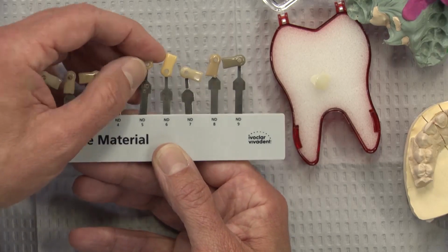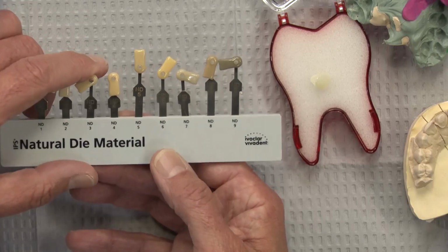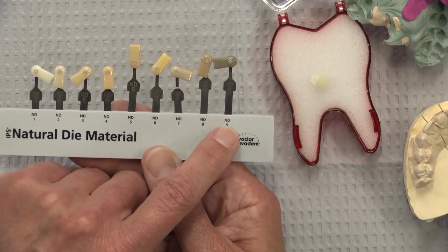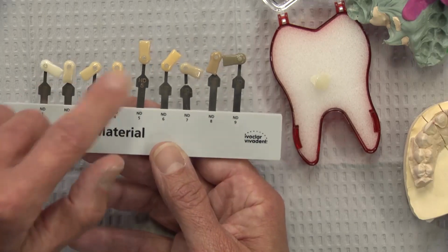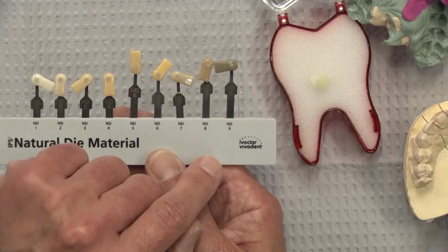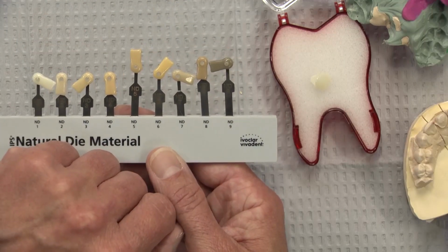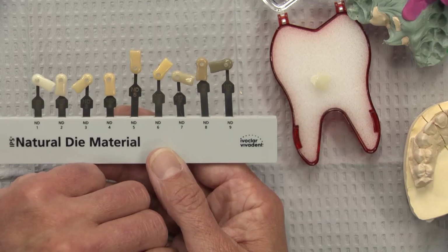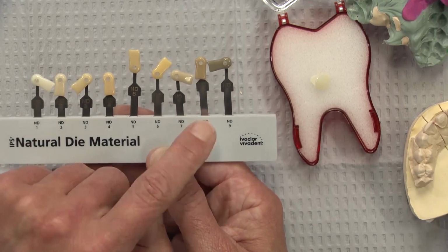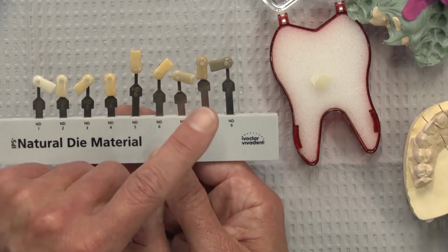And the more important thing to think of, besides just what shade these each happen to be, is if you're going to try to go from these shades, like this patient was, going from a stump of an ND9 to an A1. That's a huge leap, if you took a Vita shade guide and held it over here. When you get down into these shades, we really can't go more than about 2 shades lighter in terms of value. So to go from any of these to an A3, A3.5 would be fine. A2's a stretch, A1's a no-no, and B1's definitely not going to happen.